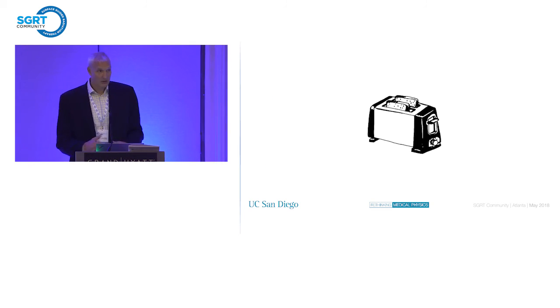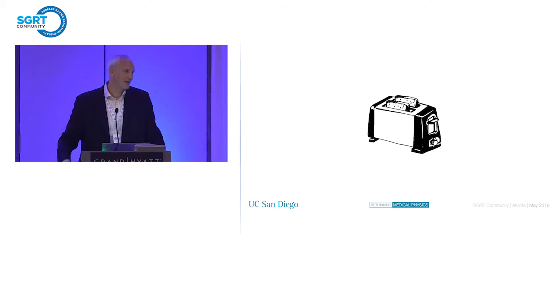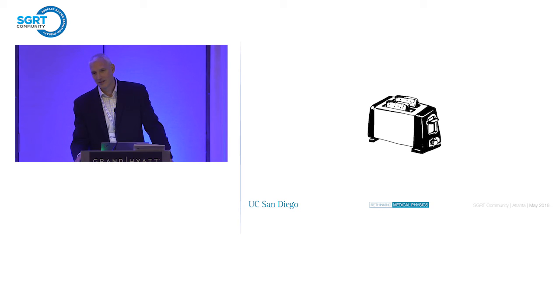Okay, let me transition here, starting to get to thinking about long-term. It takes me back when I start to think about long-term applications of SGRT. Just bear with me with the toaster here, I'll get to it in a second. When I started in the field in the early 90s, you'd get a LINAC, and the physicist brings out this water tank, and you'd measure for hours and days, and then you get the data into the planning system, and you're tweaking things, and meanwhile the clinic is yelling at you, when can we use the device, and why is it taking so long? And I used to tell the physicians, it's not a toaster. You have to do a lot of work on these things. They're very complicated. You don't just plug it in and turn it on. So just relax. We're going as fast as we can. We've got to be safe and accurate.